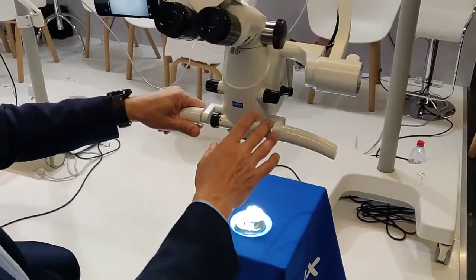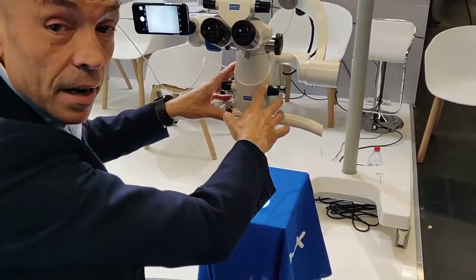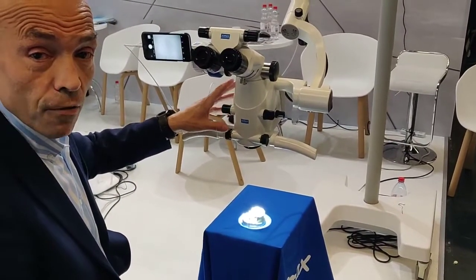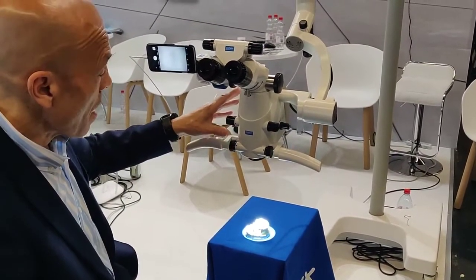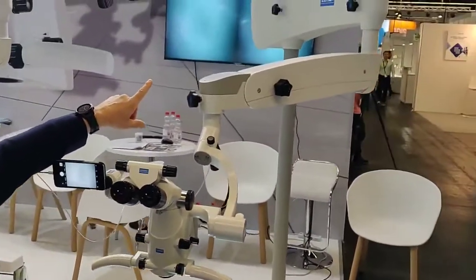In this version, we have the integrated video camera. For the integrated video camera, we now have two options. The first option is full HD with an SD card which records on the back side.